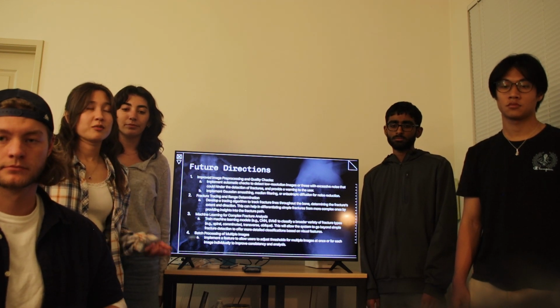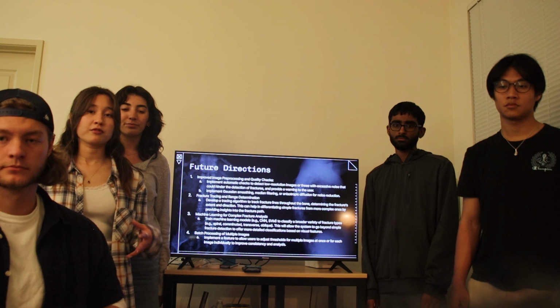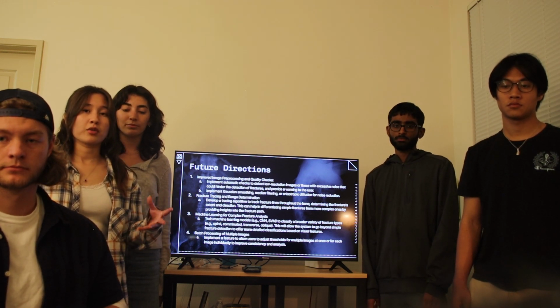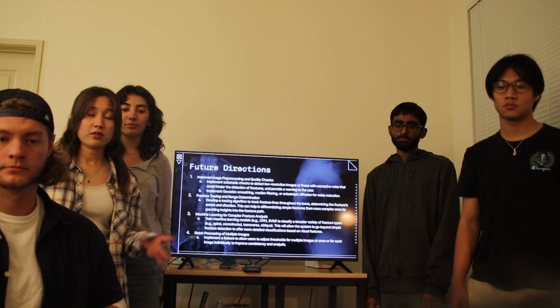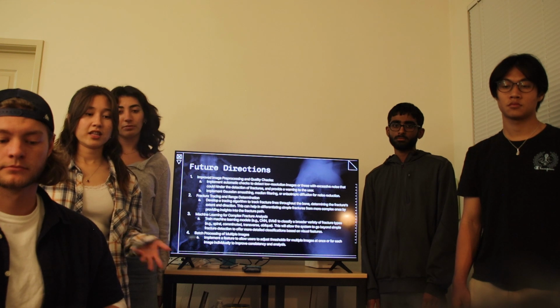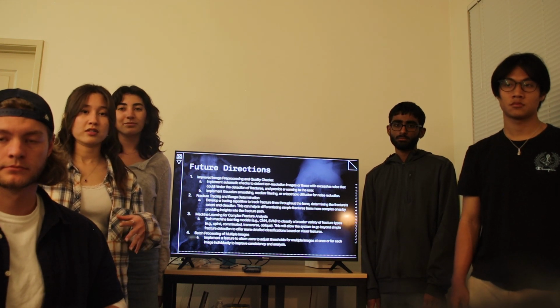And furthermore, as Tyler mentioned, if we want to design it for clinical use, we can also implement the code to be able to process multiple images at the same time using batch processing, so that multiple X-ray scans can be inputted and multiple outputs can be outputted.